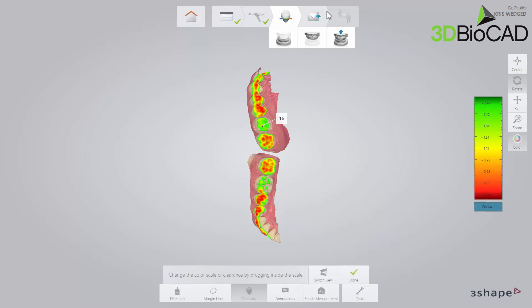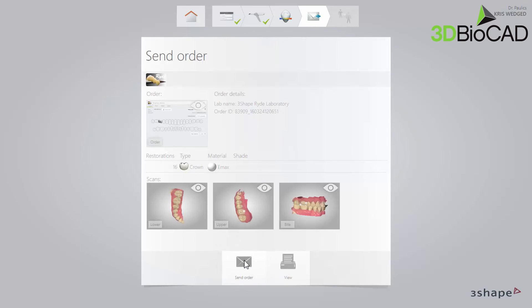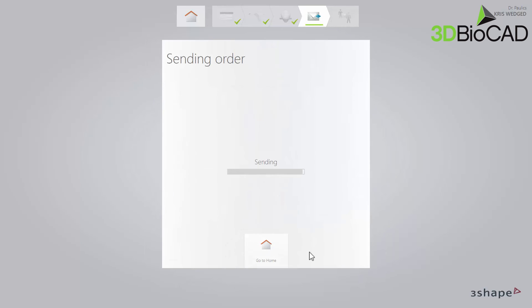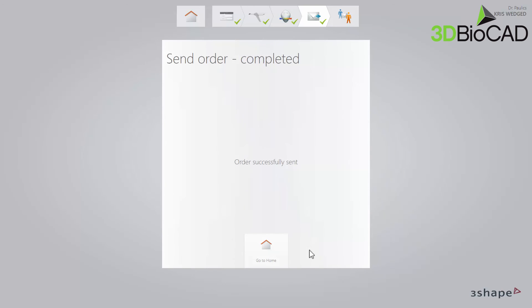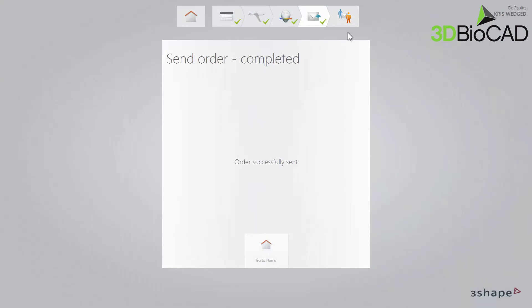Finally, switch to the Send page. Verify the order and press Send Order. When the order has been sent, the 3-shape Communicate window becomes active. You can use it for communication with the lab by writing comments and sending screenshots.